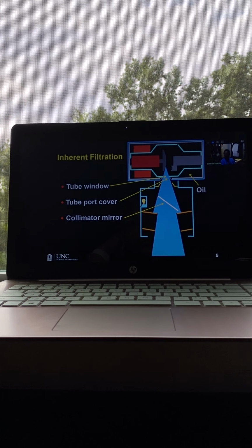They are part of the X-ray tube assembly and part of the collimator. And the main purpose isn't to serve as a filter, but since they're there and the primary beam has to go through there, they do end up serving to filter out the low energy X-rays so that patient exposure can be minimized. Okay.